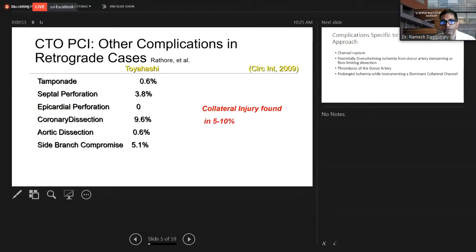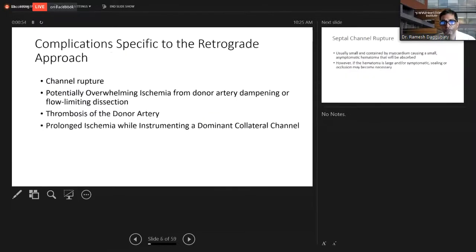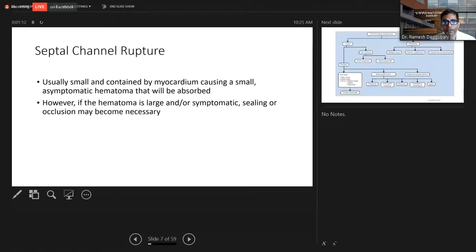And collateral injury to other vessels is about 5 to 10%. So I think these are the most important complications that we have to look at, and how we can try to reduce the rupture of small vessels, septals, and thrombosis of the donor artery and prolonged ischemia, sometimes causing acute MI. So I think we'll show some cases.